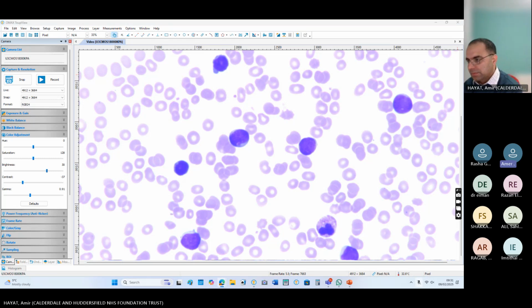Okay. So what is your impression? My impression may be acute leukemia for immunophenotyping to confirm the diagnosis.